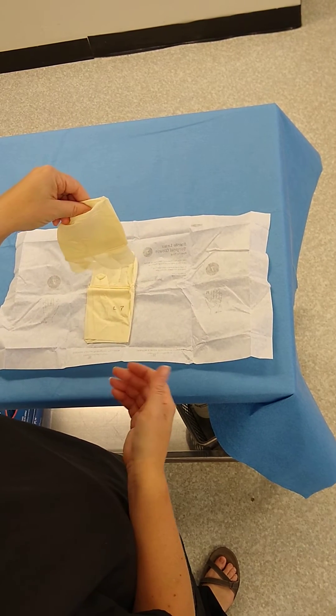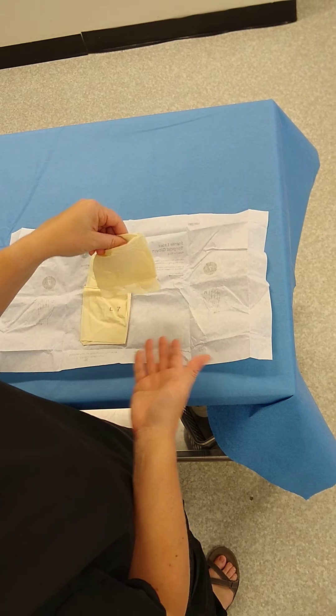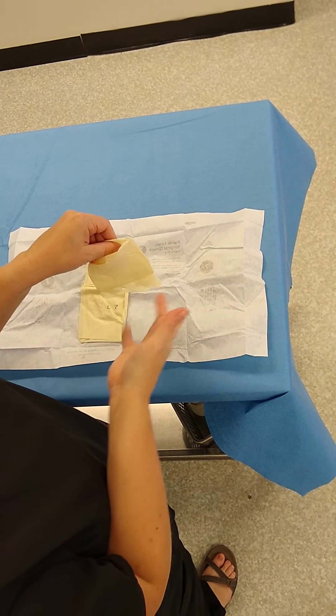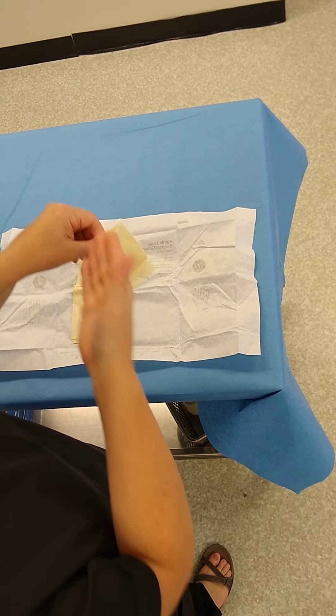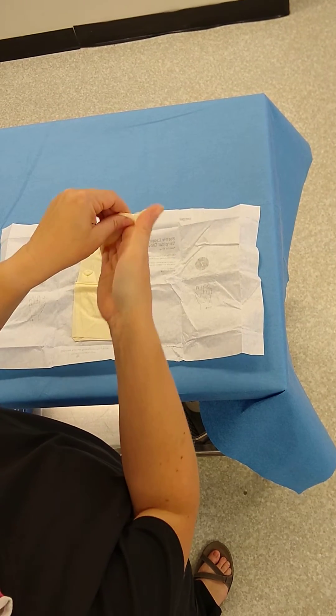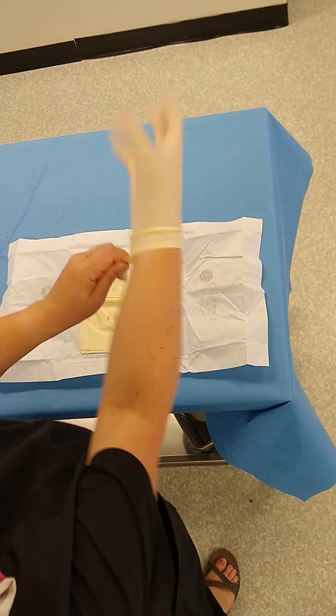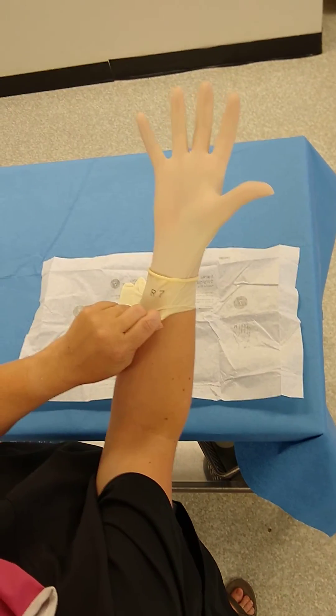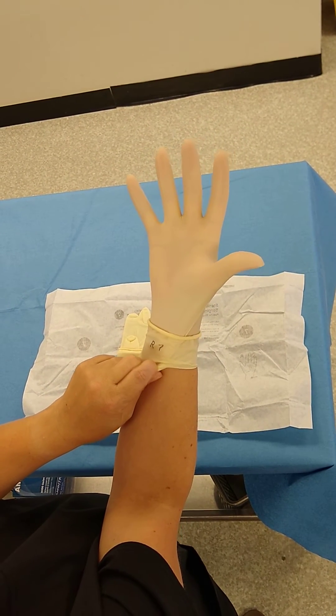I'm going to pick it up because the most common mistake is having your hands too close to the paper. While you're trying to shove your hand in, you inadvertently touch the paper or table. Make sure you lift your hands up, slide your hand inside your glove, and bring it all the way down. Notice I'm not touching the outside and I'm not touching that little lip.